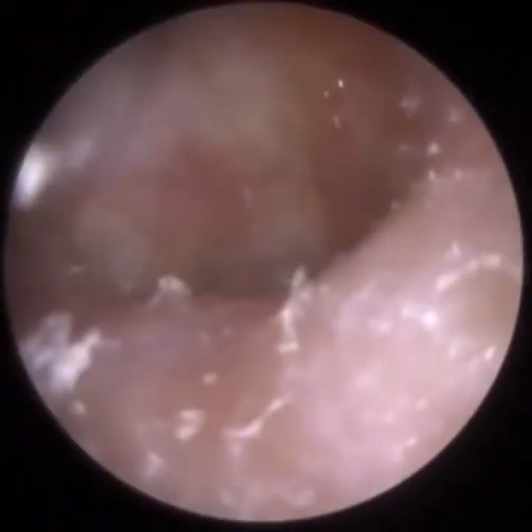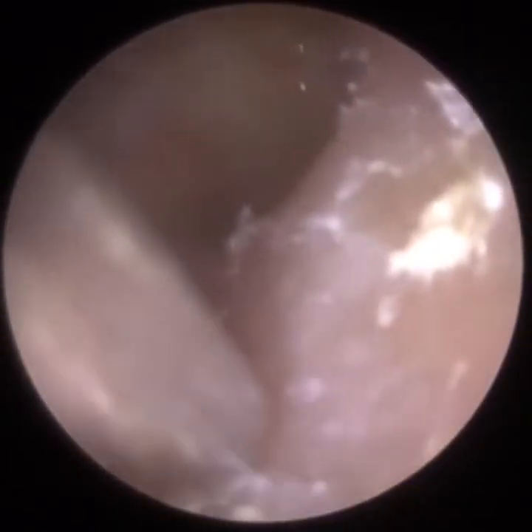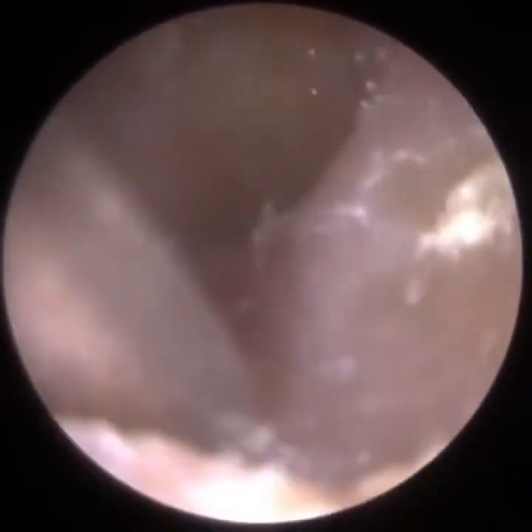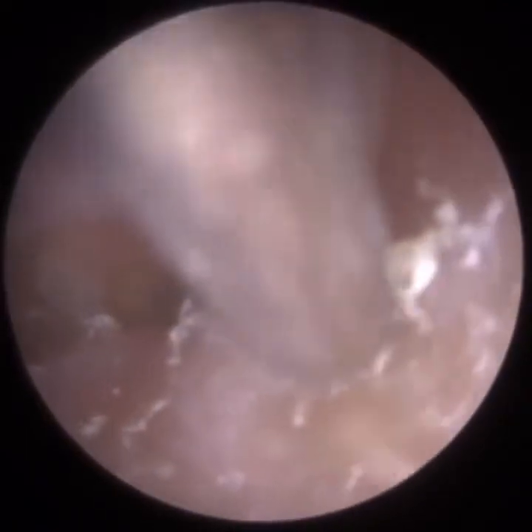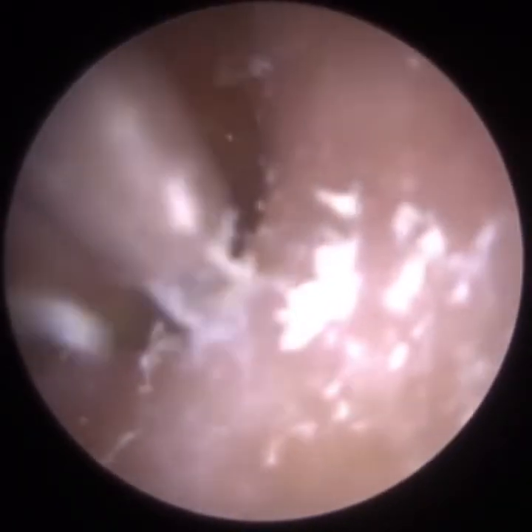So it's quite a lengthy procedure, but again, I think it was time well spent. The drier we can get this ear, the more dead skin we can remove, the longer it will take before the patient has to return to have the procedure performed again. And hopefully the simpler it will be next time as well. It won't be as complex, because today is pretty complex. There's a lot of peeling, removing stuff off the eardrum, multiple layers of dead infected skin.